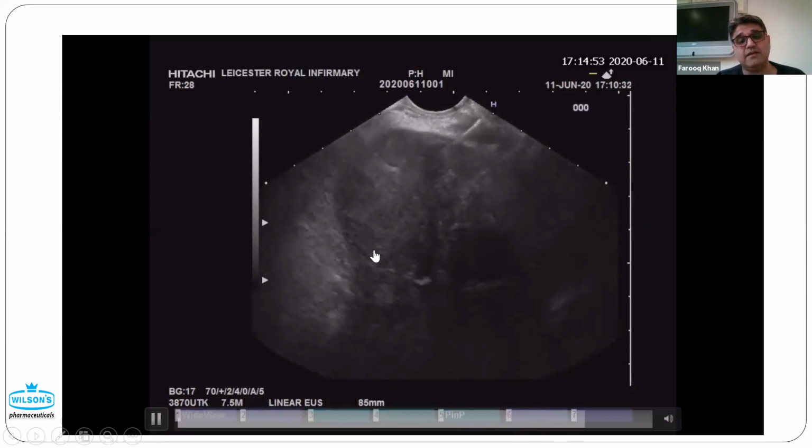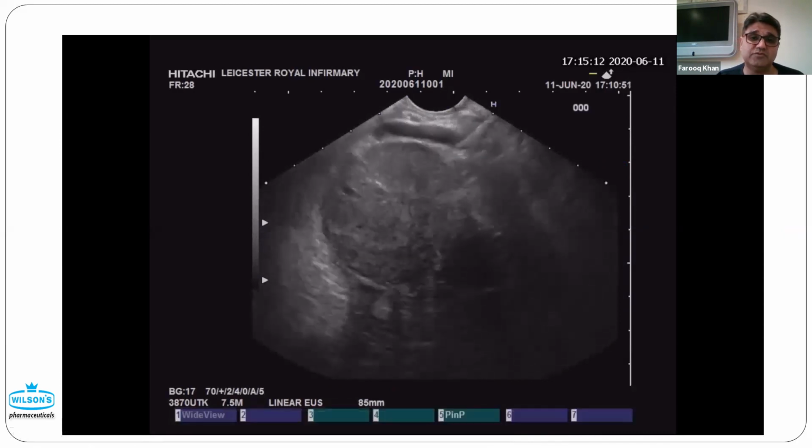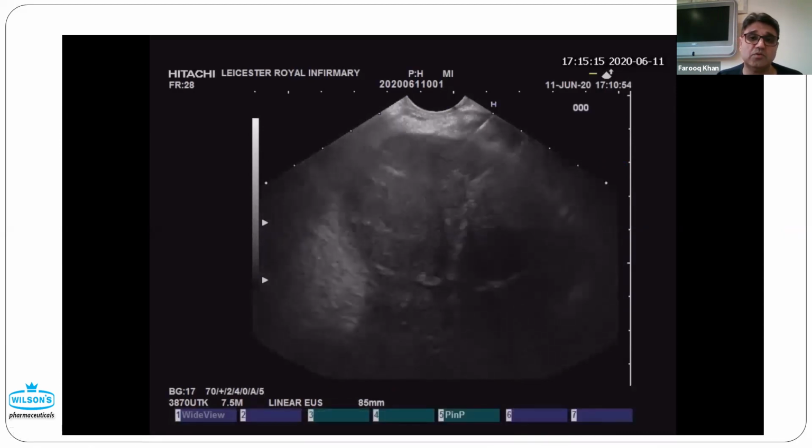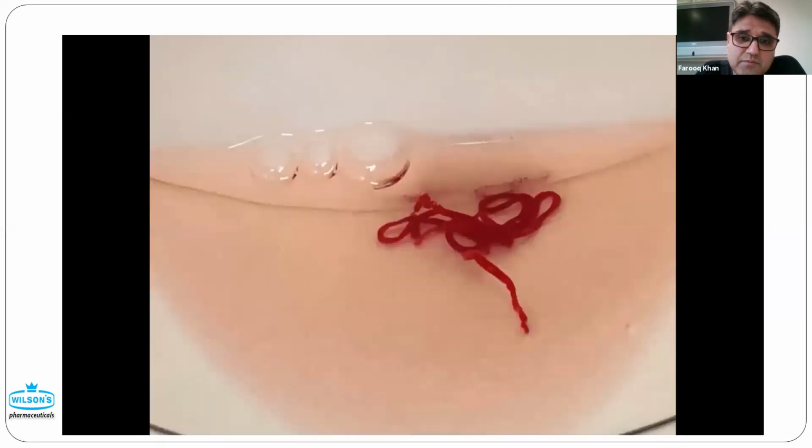And all I'm doing, again, you will see the fanning technique. I've just gone to the needle. I've not come out at all. 3 samples there. Change the position again, and then take further samples. This was the core we collected.